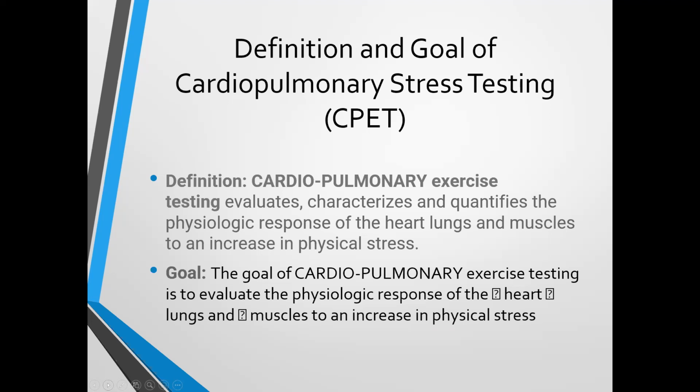So one of the things that the 6-minute walk test will not do is, in any way, distinguish between heart, lungs, muscle, or some sort of physical limitation. It won't do any of that, okay? The cardiopulmonary exercise stress test will in large part do that, providing it's performed properly.